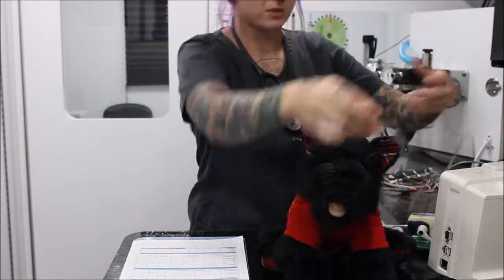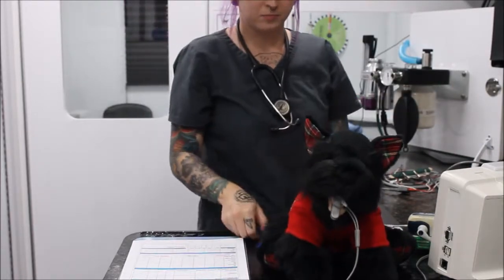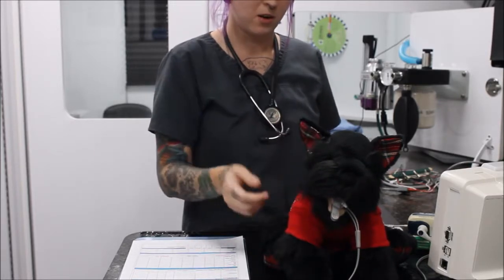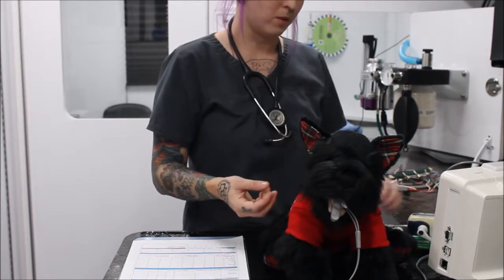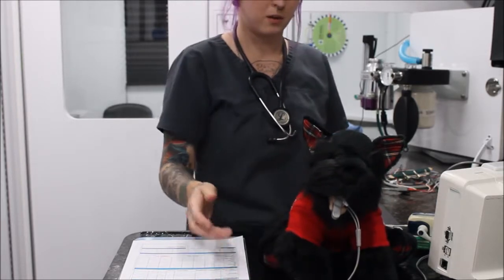You don't always have to put the SpO2 monitor on the tongue. You can use another part of the body such as the ear, the prepuce, or the vulva. We just want it to be on a nice fleshy pink part of the body. Sometimes in between the toe pads works as well.